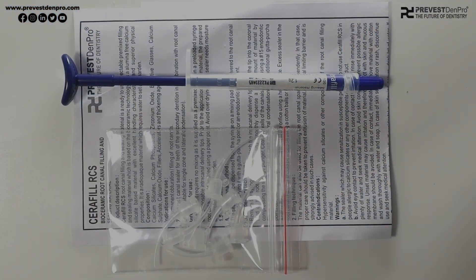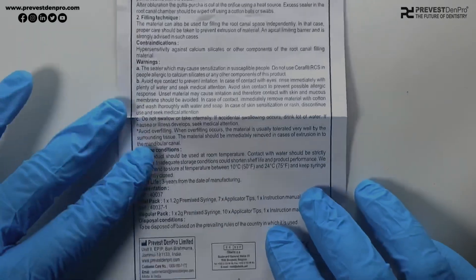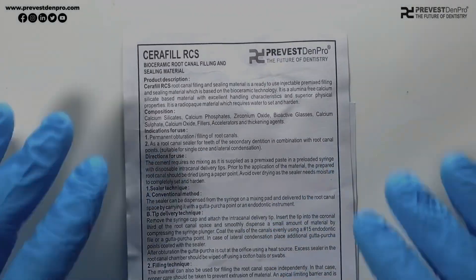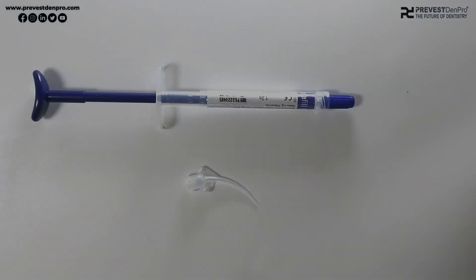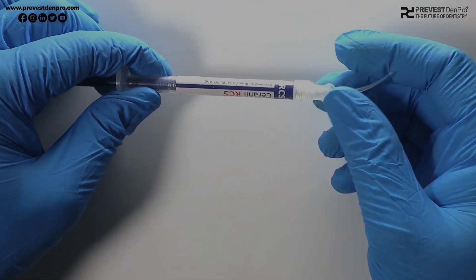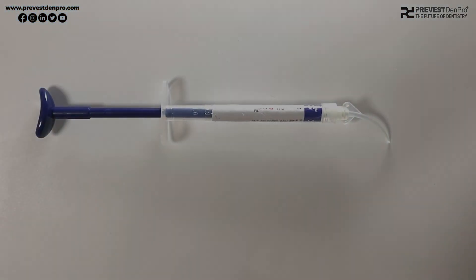We have three things: one is the tip, second is the syringe, and third is the instruction page with indications and other details about the material. The syringe is a pre-mixed syringe containing the Seraphil RCS bioceramic sealer along with a delivery tip. We need to fix this delivery tip by screwing it onto the syringe, and then we are ready to dispense the material.